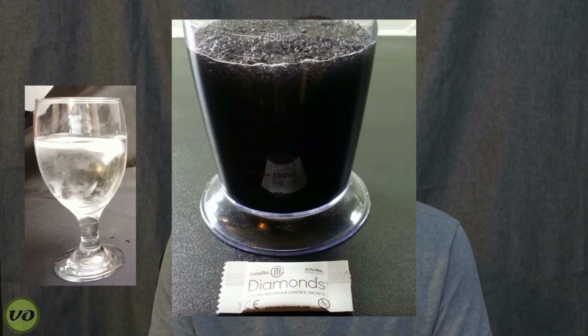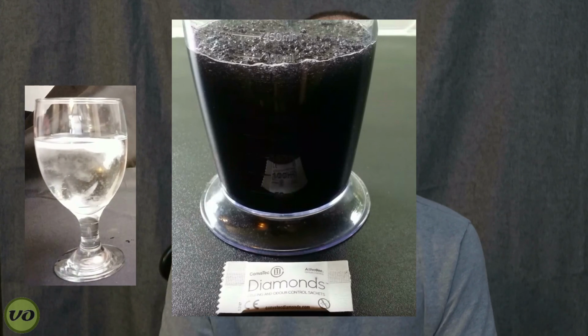so there's quite a few things actually that make liquid output pretty difficult to manage. Now, if you've seen my other video on how to manage liquid output, you'll know that using a gelling product is one of the recommendations that I give. And that's for good reason. Now, I've been used to using the diamond sachets, and the diamond sachets are very similar to these. But the diamond sachets tend to make the contents of your bag black, and that can be pretty alarming to some people, and it looks pretty off-putting. Now, the pearls from Trio are actually white, so they don't look really crazy when you're emptying your appliance.